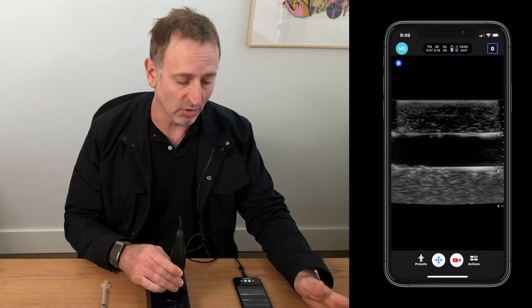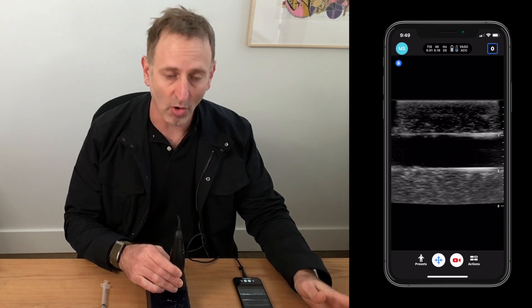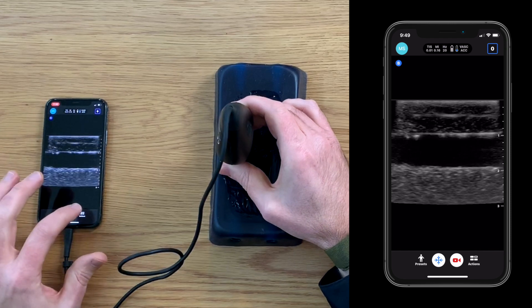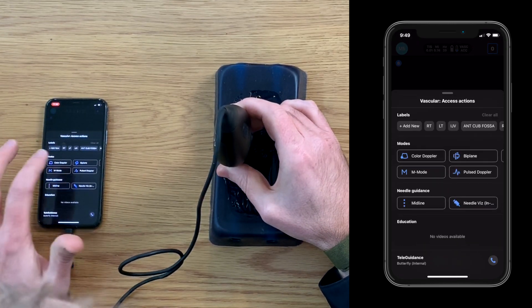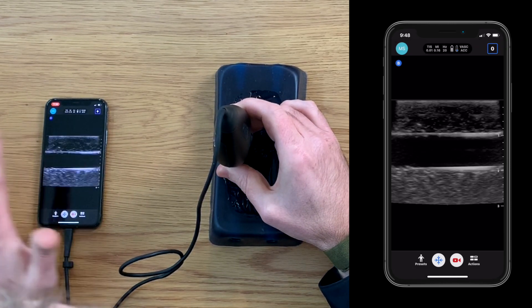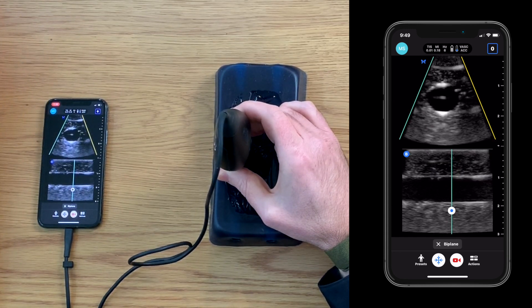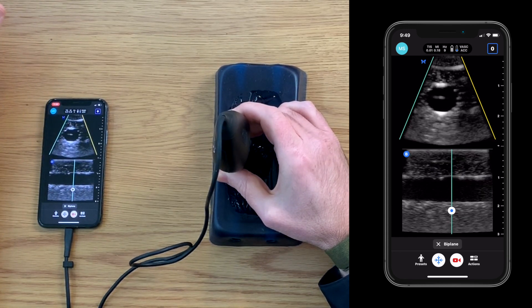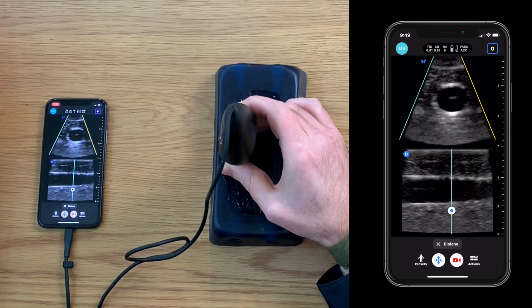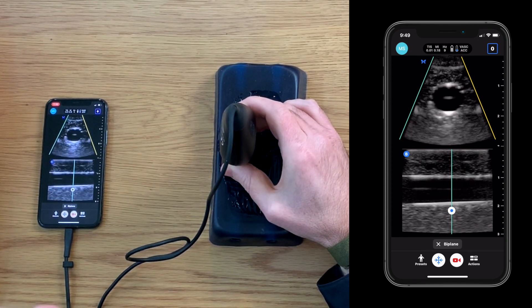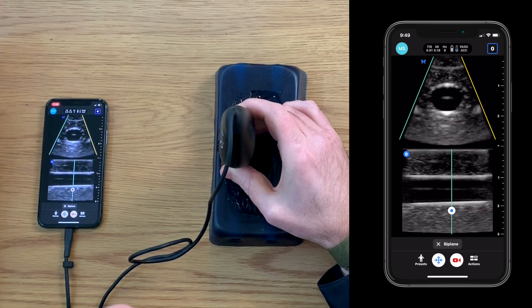Biplane imaging allows us to do that at the same time without having to re-manipulate the probe. I'm going to go into my actions tab and select biplane. What we can see here is that we now have two simultaneous images on the IQ screen — on the bottom image we have a long view of this vessel, and on the top image we have a short axis view.